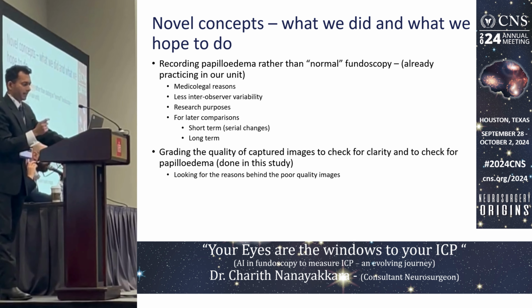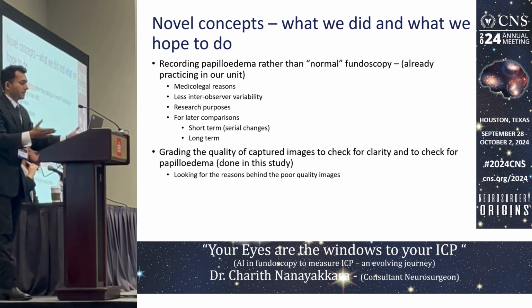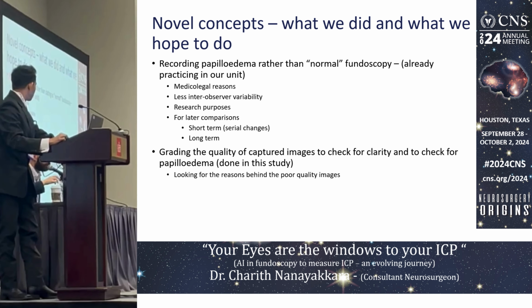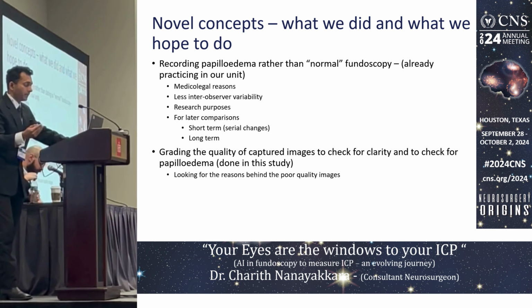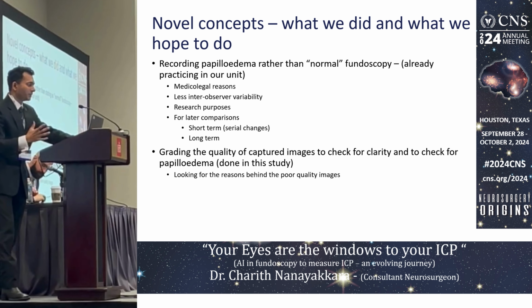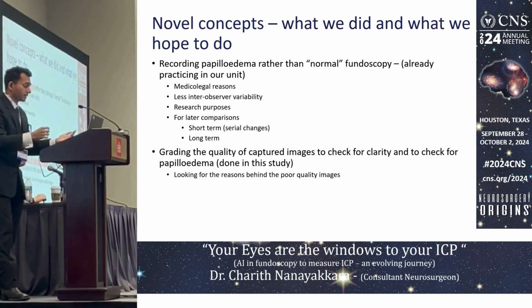So recording papilledema, rather than stating just normal fundoscopy, is what we are practicing at the moment in our unit. Due to medical legal reasons, for instance, this will lead to less interobserver variability, and also for research and for later comparisons. Now let's say a patient has diabetic retinopathy, and then you have another fundal image to compare. There are so many uses for fundoscopic image recording, other than within the realms of neurosurgery.